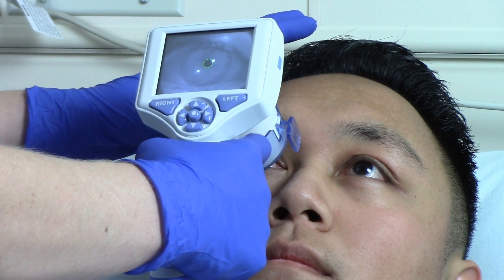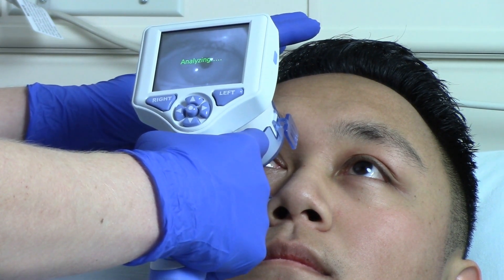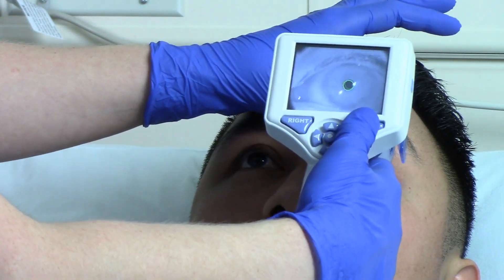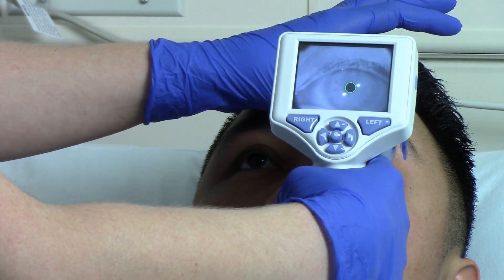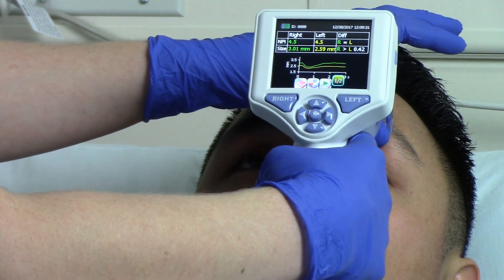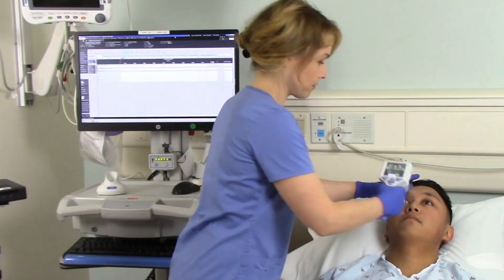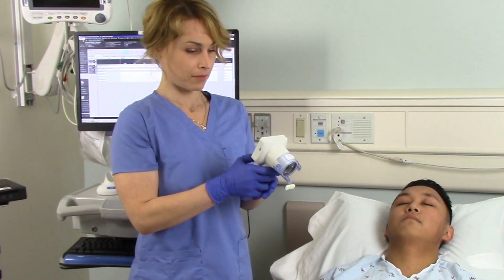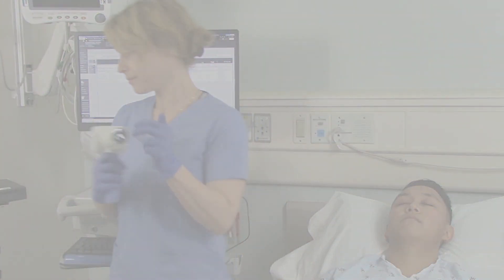Most importantly, the pupilometer expresses pupil reactivity numerically so that now for the first time ever, both pupil size and reactivity can be trended for changes just like other vital signs. The most effective way to use the pupilometer is to establish the earliest possible baseline measurement with the first neurological exam when the patient is admitted into the ICU, the emergency department, or the post-anesthesia care unit, and then trend for changes over time following standard pupil assessment protocol.